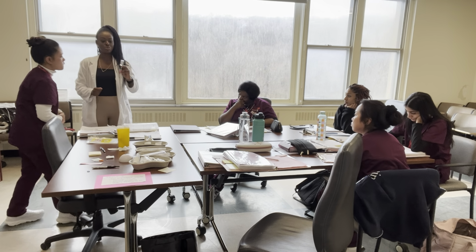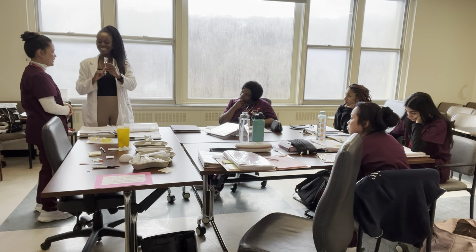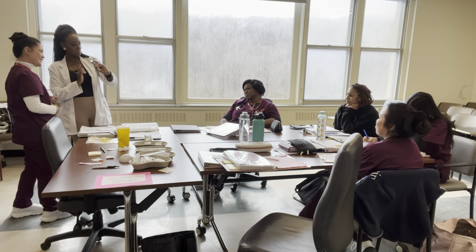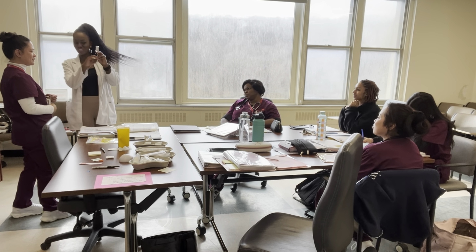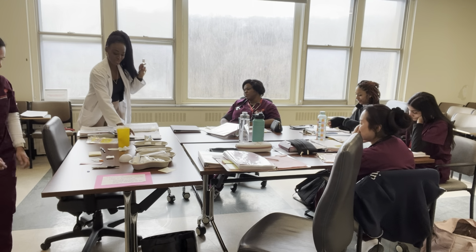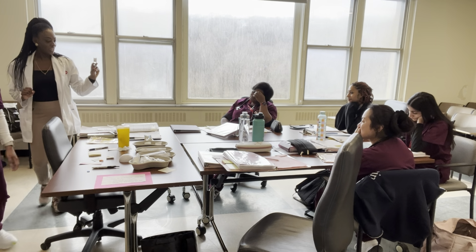Okay, then I will show her what I have. After that, she will check to make sure that it's the right drug. It's good, she said. Usually they check the right drug, they'll make sure that it is Humalog, that it is not expired, the date it was last opened, and that it is the right amount. It's verified? Yes. Then you will put the number down that we got, so you can just pretend, you don't have to write on the paper, so she would put 5.